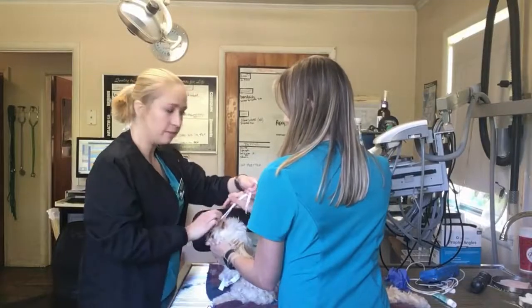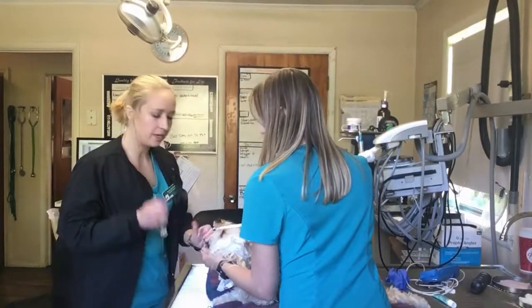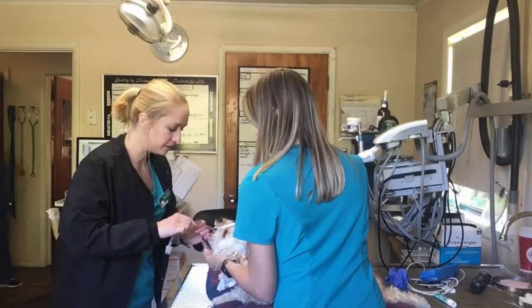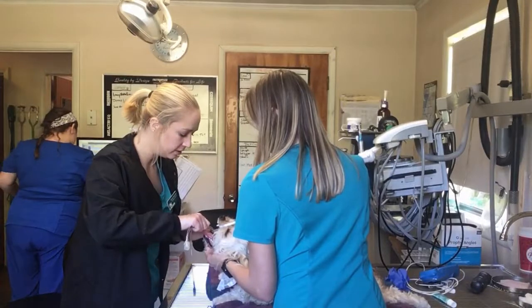Alright, so when you're inducing her, I'm going to have someone assist me and hold open her mouth. I already have my tube looped up and ready to go. And then I'm going to hold open the tongue.